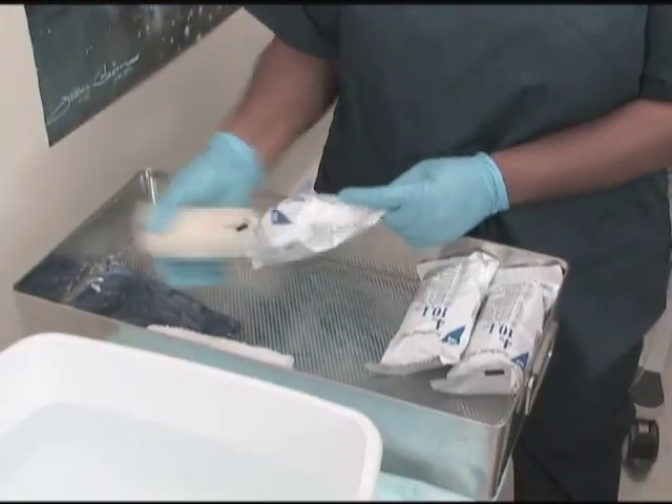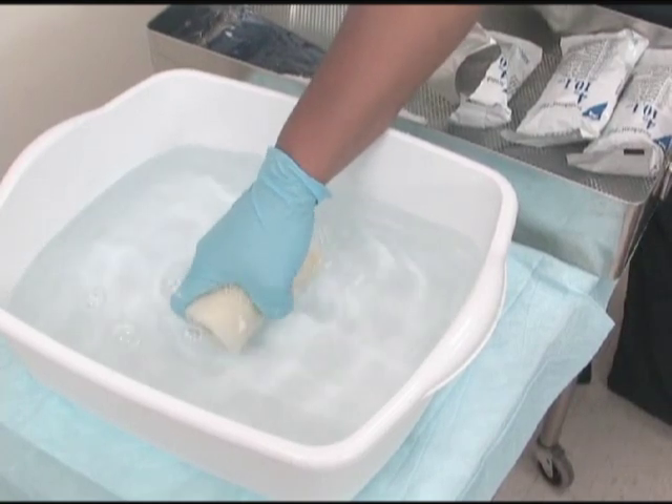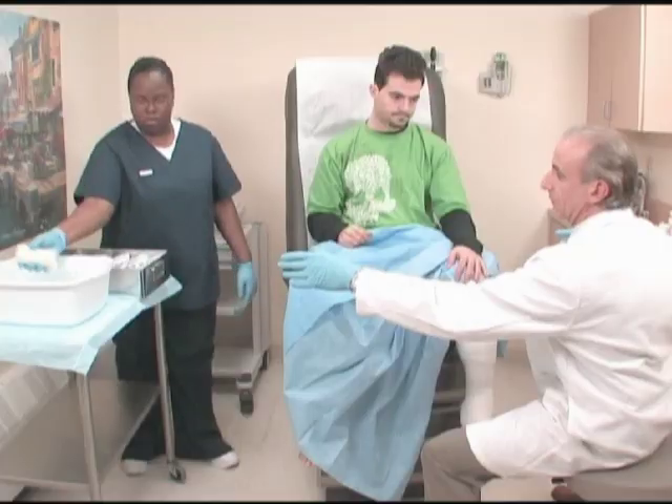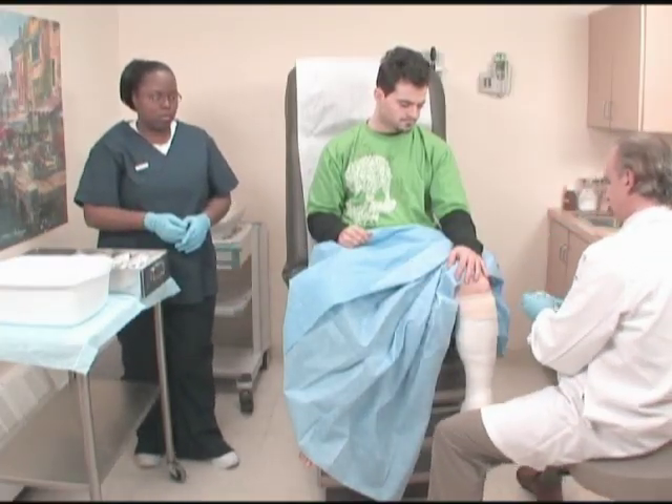When the physician is ready, soak a roll of fiberglass tape for the inner cast in the basin of warm water. The tape material will activate on contact with the water, so only wet as much as you need at one time. Hand the soaked tape to the physician, who will roll and form the inner cast.